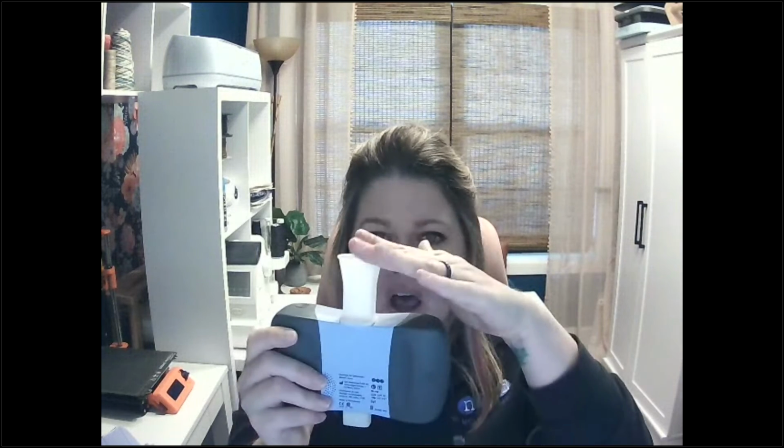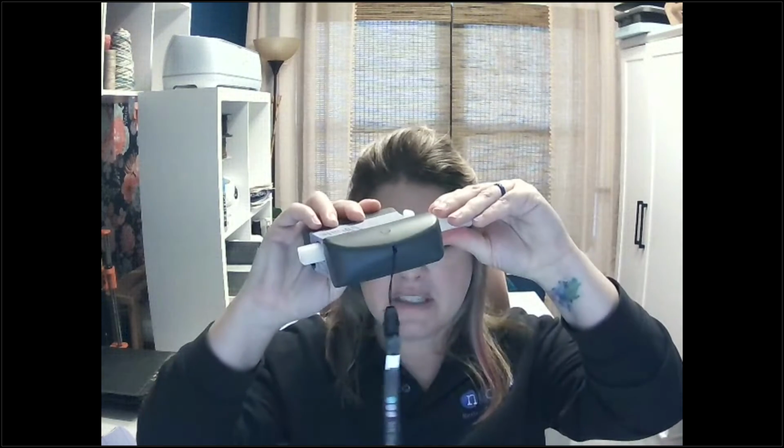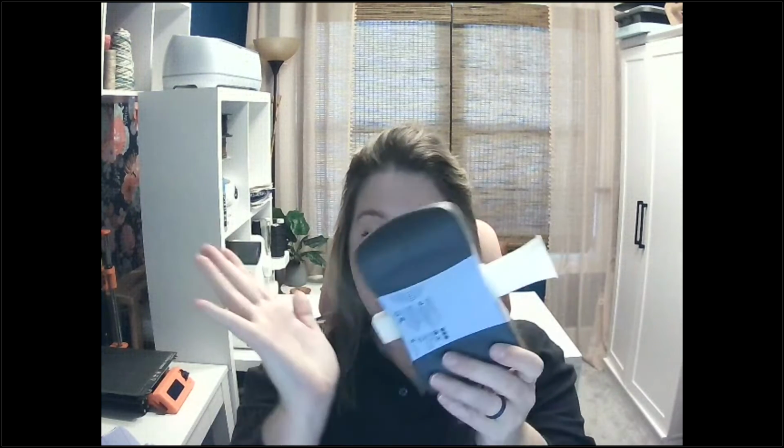The next thing it is going to prompt me to do is to block the flow tube mouthpiece while that ultrasound sensor does a quick zero of itself. It's setting that baseline setting. Very commonly, people will leave the plastic on the front side of the mouthpiece during this test. You can use a gloved hand to the back, just as long as there's no air moving through the device during this quick set of baseline. So I'm going to go ahead and block the mouthpiece and click OK.